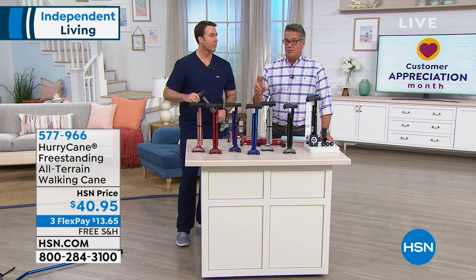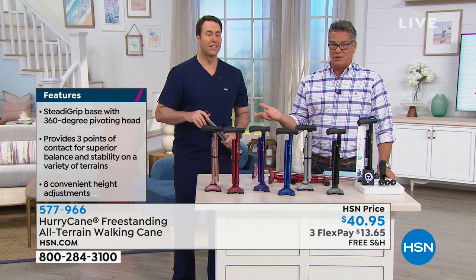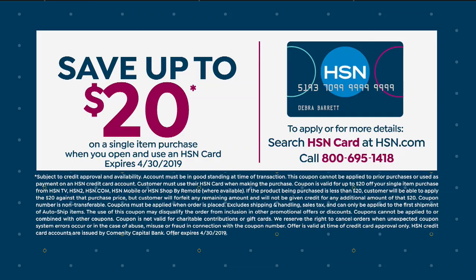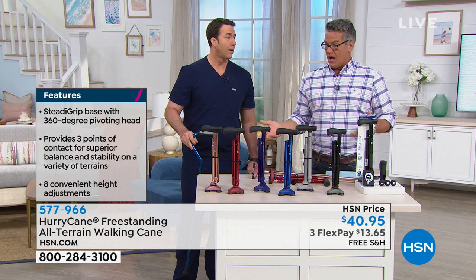Remember that we have our $20 off coupon that goes along with a brand-new HSN credit card — you can apply it to this too. So if you're a brand-new customer, what a great deal. For $21, you can get a cane — all you have to pay is the tax because the shipping and handling is free. And this is one of the things we're doing for Customer Appreciation Month here. We appreciate you so much, and it's wonderful to get your feedback, especially on things like the HurryCane, which is a great customer pick.